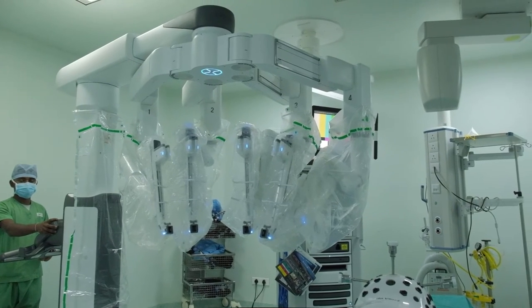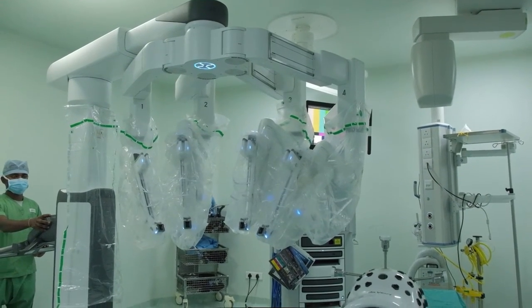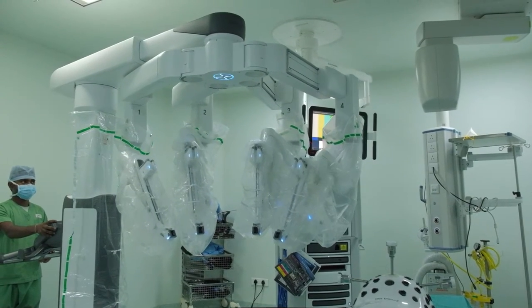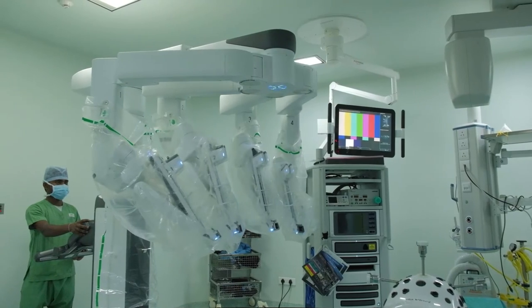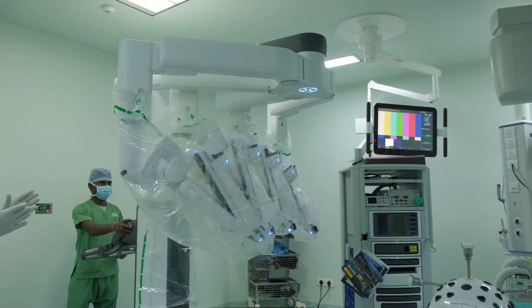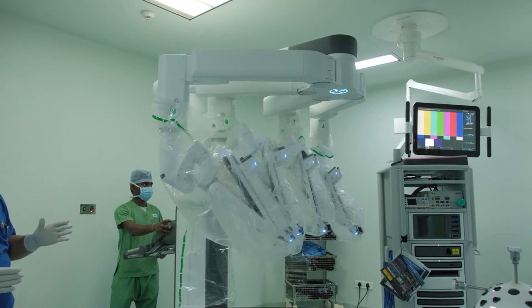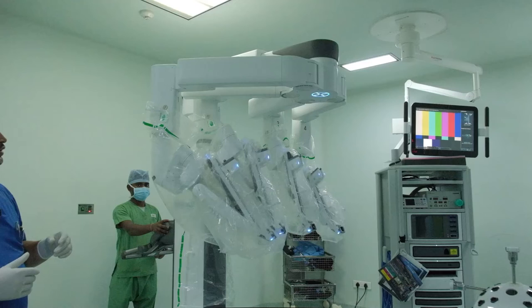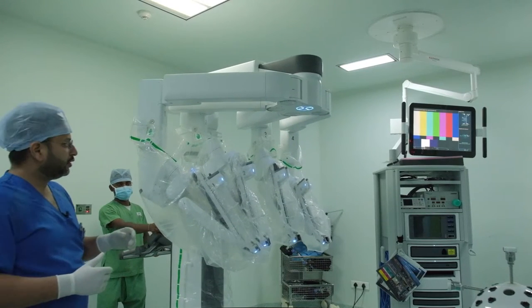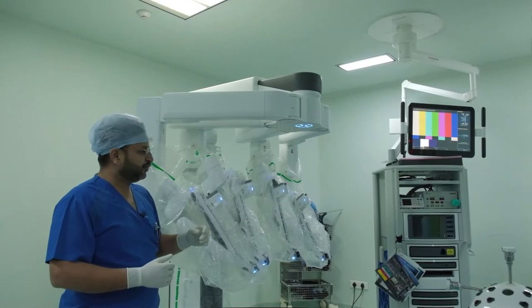Mr. Roshan Kumar is going to press the stow button and keep it pressed. So this is how the boom is going to rotate, and all the arms are going to fold, and the boom is going to go back to its original position so that the patient cart can be stowed. You can see how the five movements are done, and the boom has taken its original position.